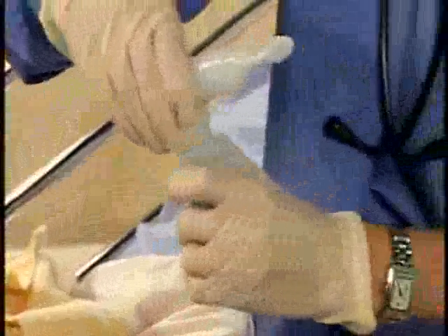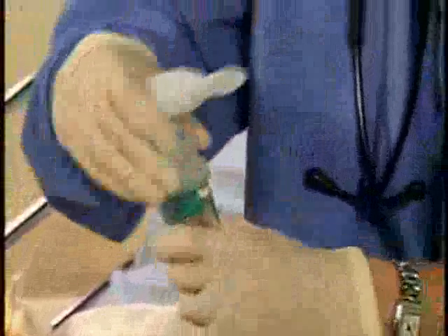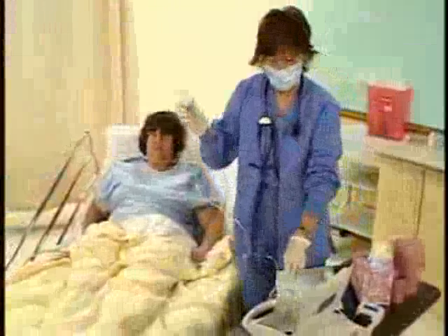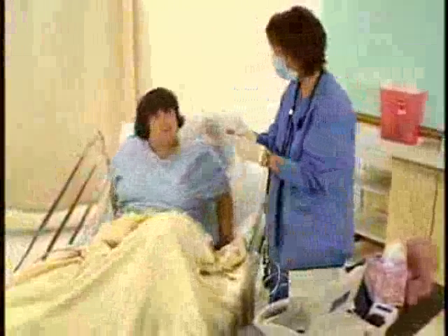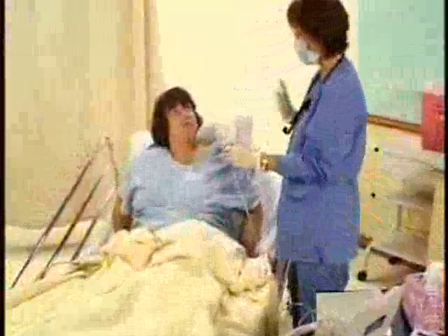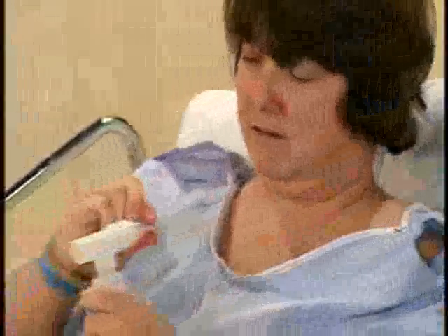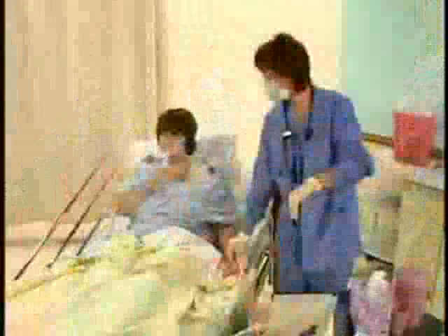Fasten the T-piece to the top of the cap. Always avoid touching the nebulizer mouthpiece or the interior part of the mask. Before turning it on, adjust to 6 liters per minute or less per the physician's orders. This drives the medication into a mist or wet aerosol form.